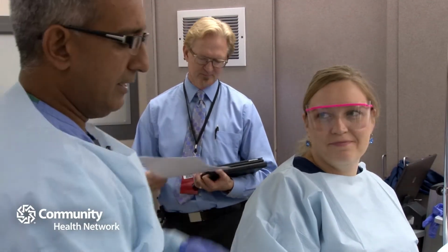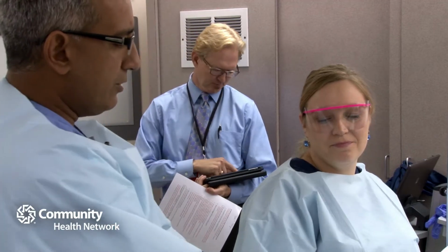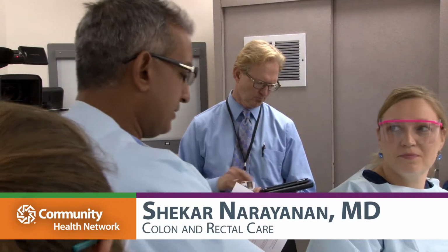All right, well, thank everybody for joining us. So basically, what I do to begin is I will just do a quick rectal exam on her, or an exam of the anus, just making sure I don't miss anything. We check the sides, check the front on a female, check the front on a male, and the back, just to make sure I don't feel anything in the anus. And then this is the scope that we're going to be using, and we'll pass that in and start looking.